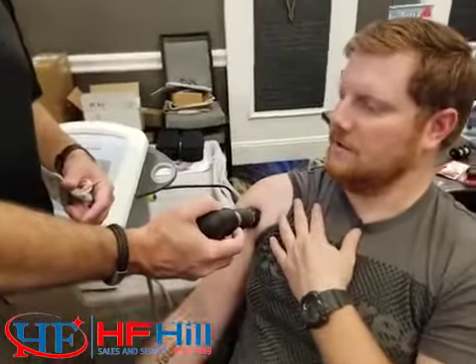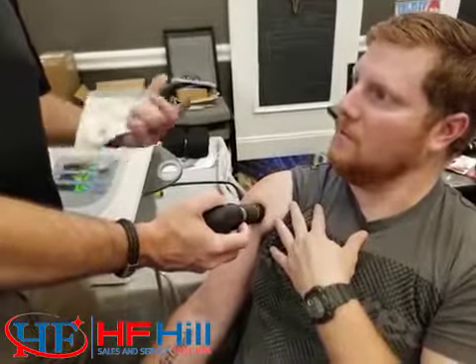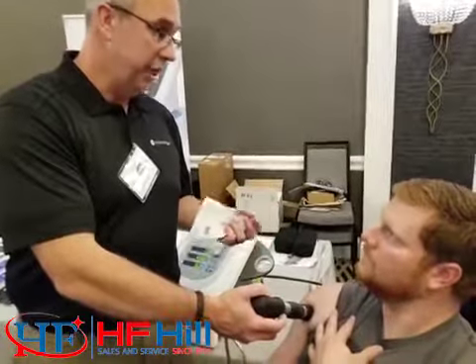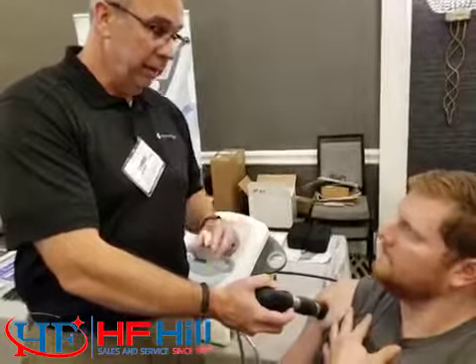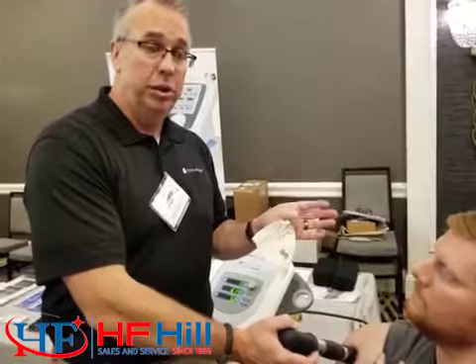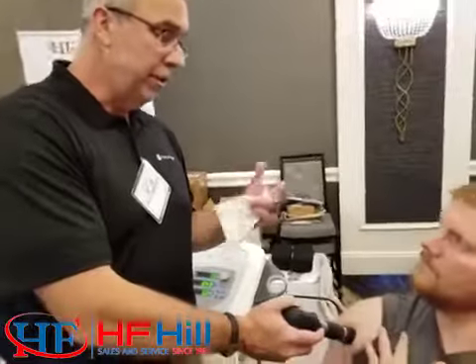Now, Chris, would I feel it not just in the spot where the applicator is, but all around it? Is that normal? Depending on what is in the area, if there's any bone, then some of that wave pattern will hit bone, and that will create some referral with regards to where you're feeling this. But it's a fair amount of energy, right? I don't know if you want to call it an echo pattern. That echo pattern actually is acoustic, and because this is referred to as radial pressure wave versus focused shock wave, the radial pressure wave is going to create a diverging pattern, which is the opposite of focused shock wave, which creates a converging pattern. So there is more of a tendency to feel it.